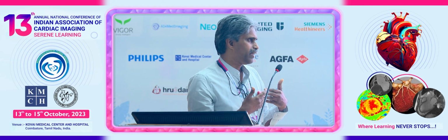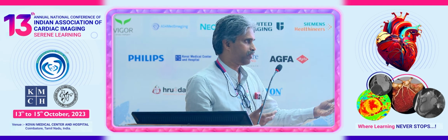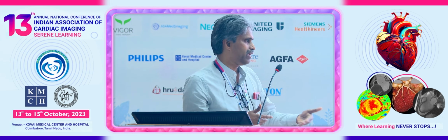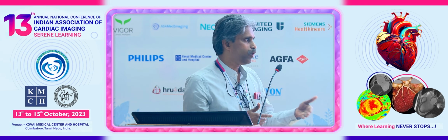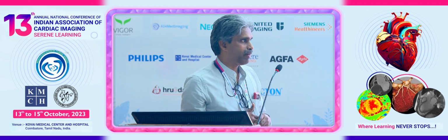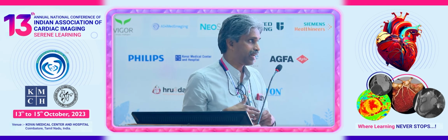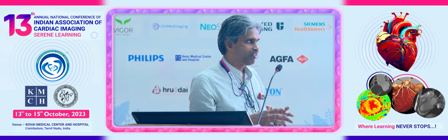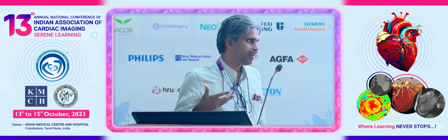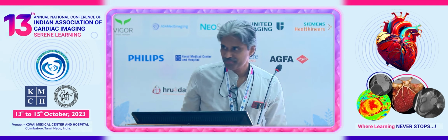In general, you don't need regular follow-up with cardiac MRI. Once you make a diagnosis, you can follow up with echocardiography. But if there is any doubt on follow-up, say at a 3-month or 6-month interval, or to know whether there is an ongoing myocarditis, then you can repeat the cardiac MRI and see whether at least the myocardial edema is reversing. Those are reversible, whereas LGE may not reverse completely. It may take time, and sometimes it may persist for many years. But generally, T2 values usually come down over a period of time. Thank you very much.